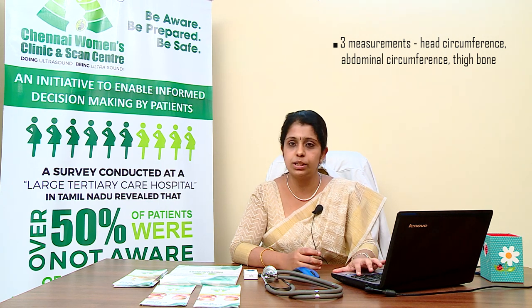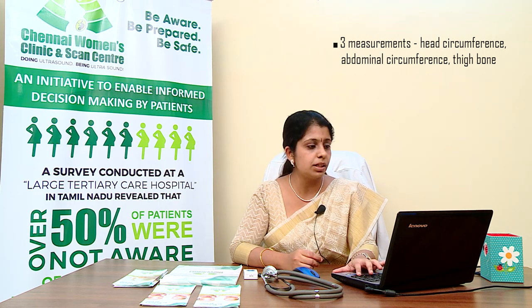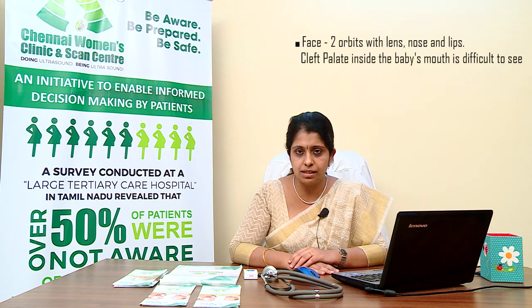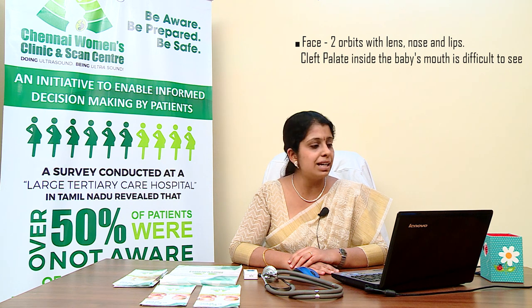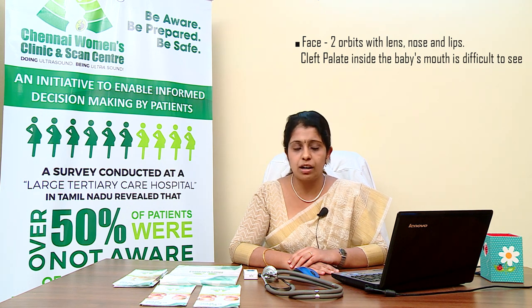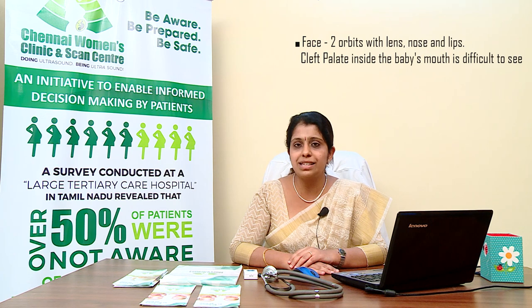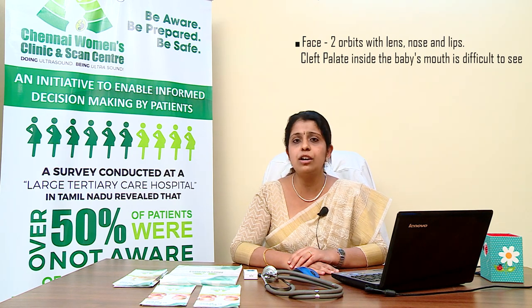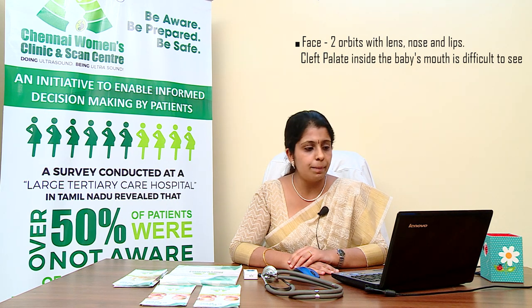Any impairment in brain development is visible at this stage. In the baby's face, we see two orbits with lens, nose, and lips. We also check for cleft lip — that is, a breach or discontinuity between the nose and the lip of the baby. However, cleft palates are often not picked up as they are inside the baby's mouth and are very difficult to see.